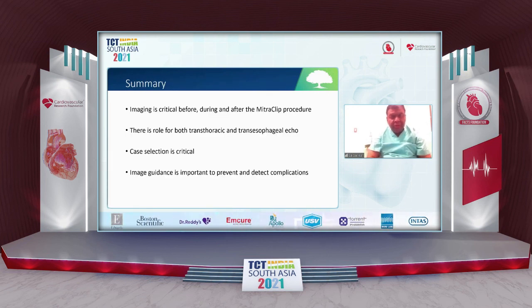So I would like to summarize that imaging is critical before, during, and after the clip procedure. There's a role for both transthoracic and transesophageal echo. Case selection is critical, and image guidance is important to prevent and detect these complications. Thank you very much.